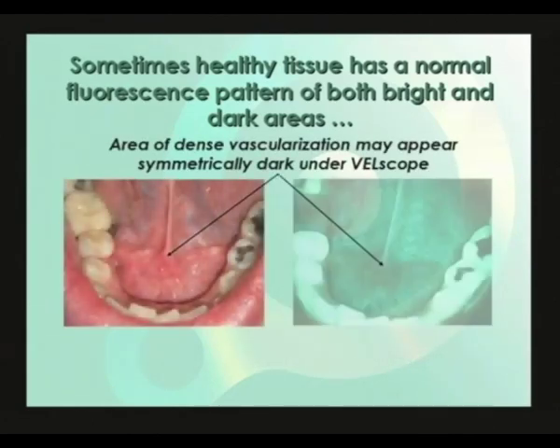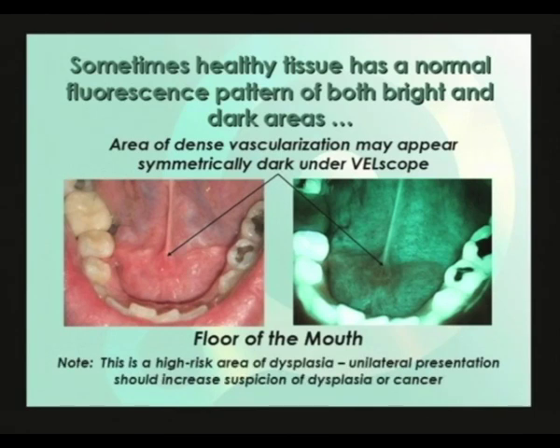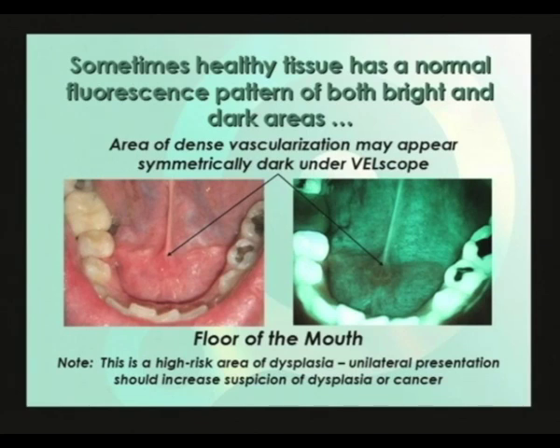Here we see a Velscope picture of the floor of the mouth and the corresponding area under white light illumination. The ventral surface of the tongue is also partially visible at the back. The area around the submandibular gland ducts can be well vascularized, and is particularly so in this example, showing up as a symmetrically dark area under Velscope. Although the symmetry and shape of this dark area is suggestive of normal tissue, the floor of the mouth is a high-risk area for dysplasia. Watch out for non-symmetrical areas giving a unilateral presentation, as these should increase suspicion of dysplasia or oral cancer.